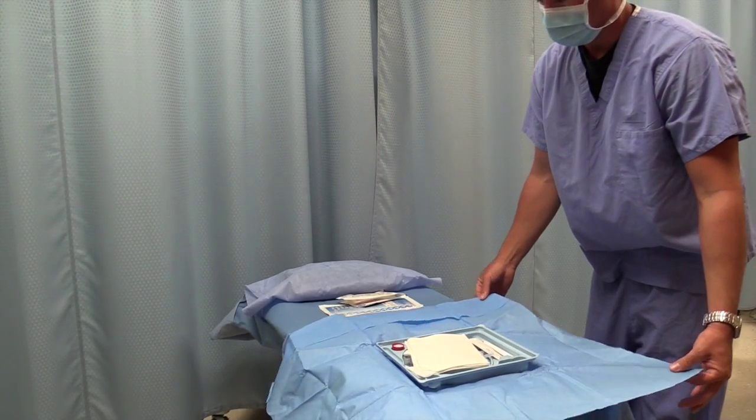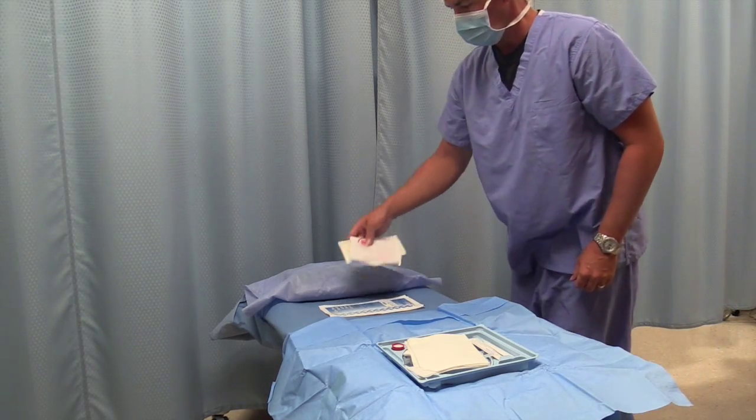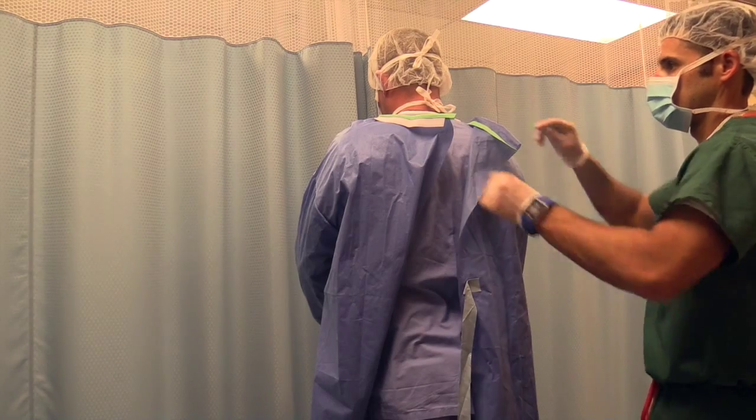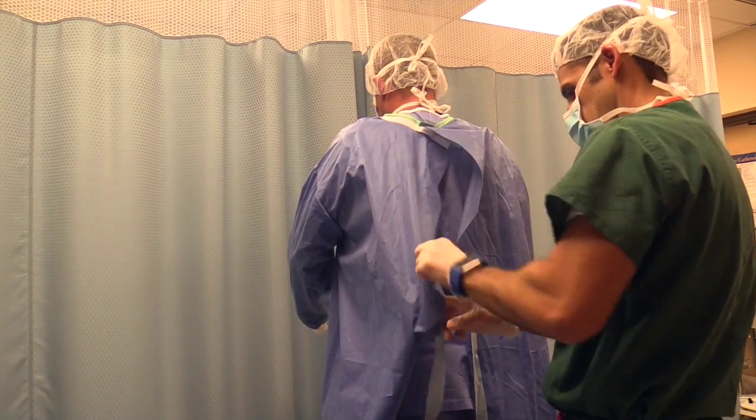Today, we are going to be looking at central line insertion. You would begin by opening up the kit under a sterile fashion and donning the gown and gloves in a like fashion.